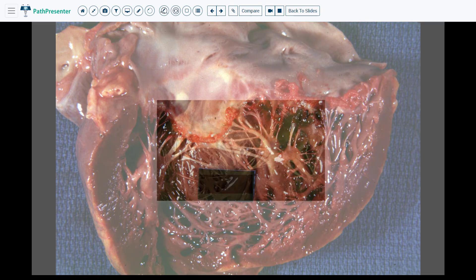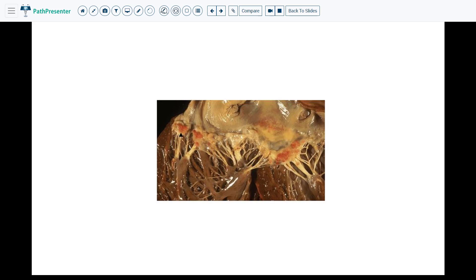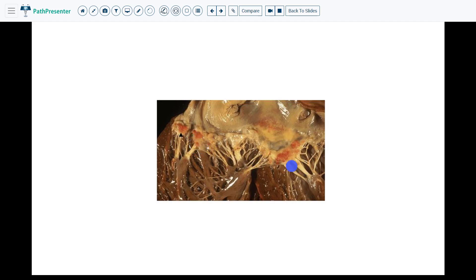Case 6 is Libman-Sachs endocarditis, which is a type of endocarditis associated with lupus. This area up here is the left atrium — you can see it is smooth. The opening of the left atrial appendage is right here. Here is the mitral valve, the chordae tendineae, and a papillary muscle. The light pinkish-orange areas are the vegetations on the leaflets. Libman-Sachs endocarditis also has vegetations on the chordae tendineae, which is very characteristic of this condition.